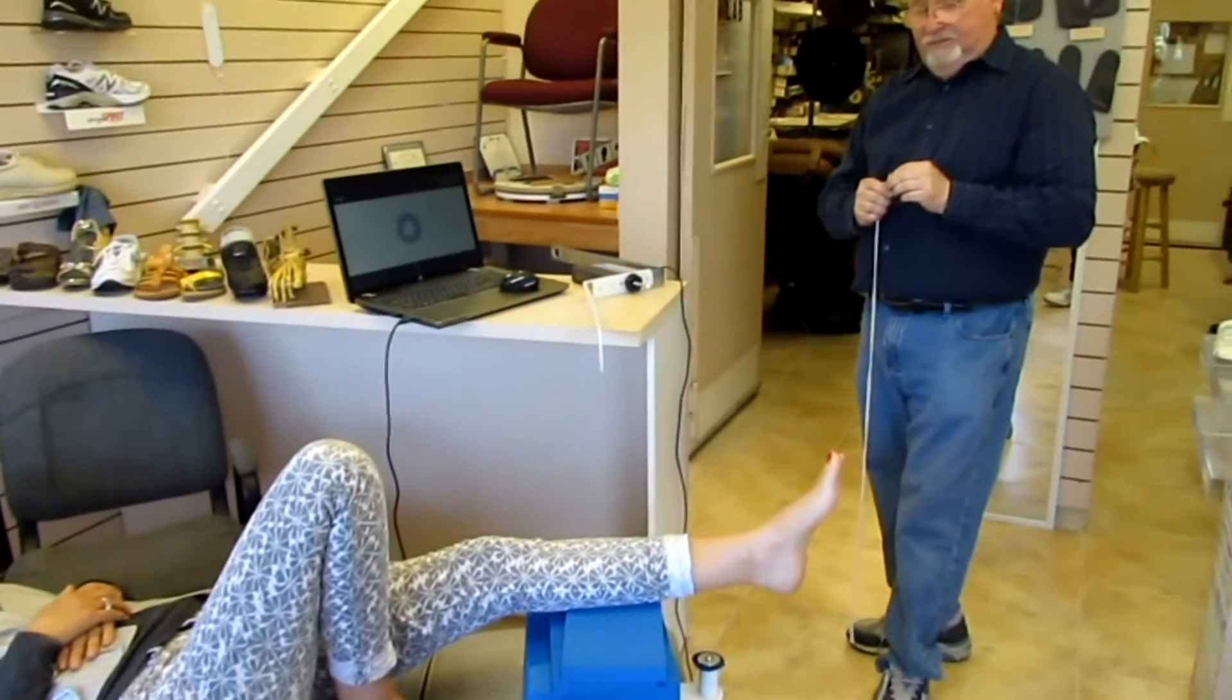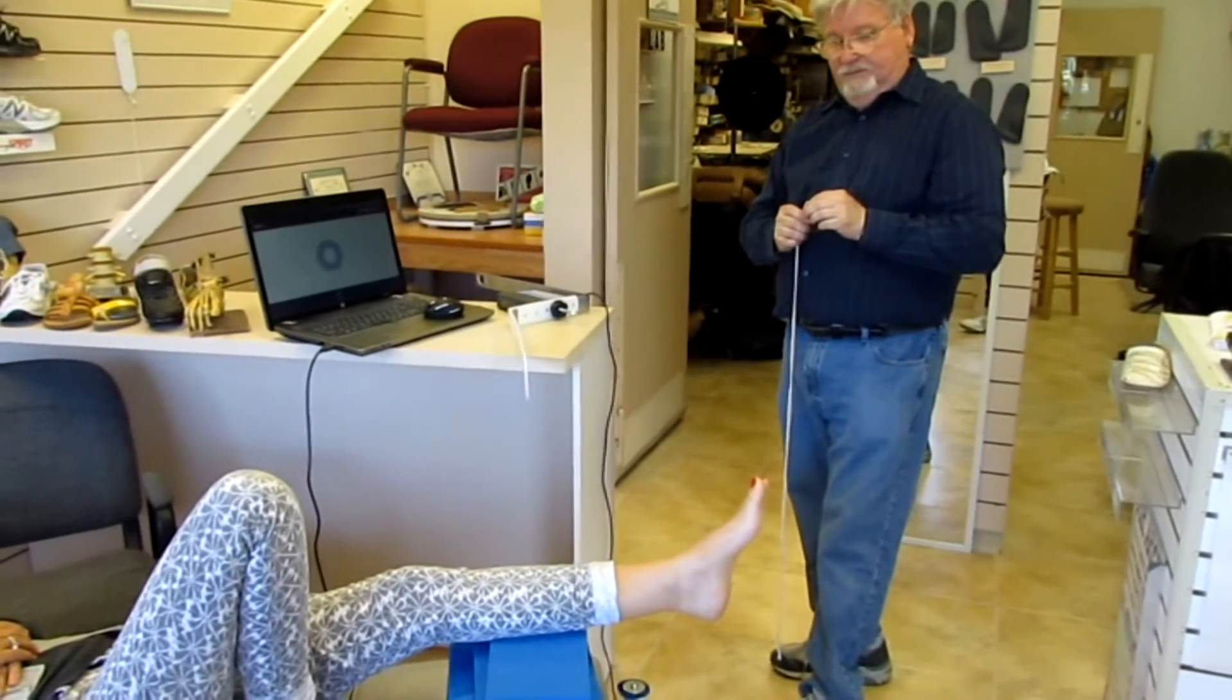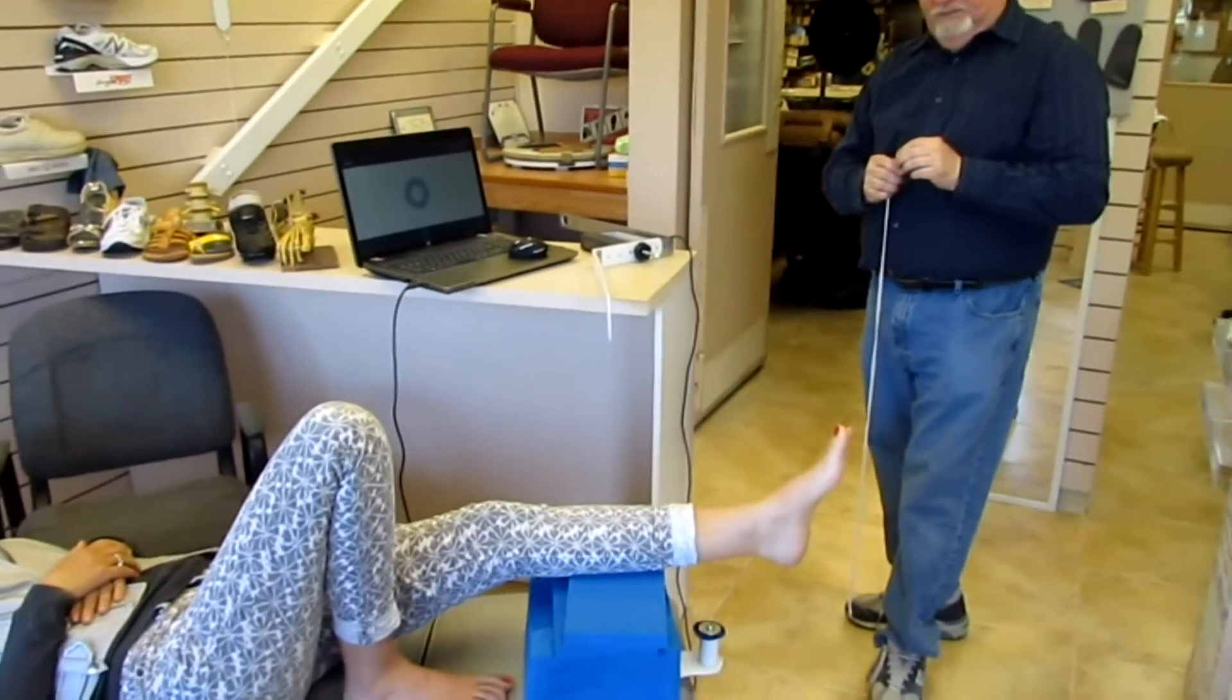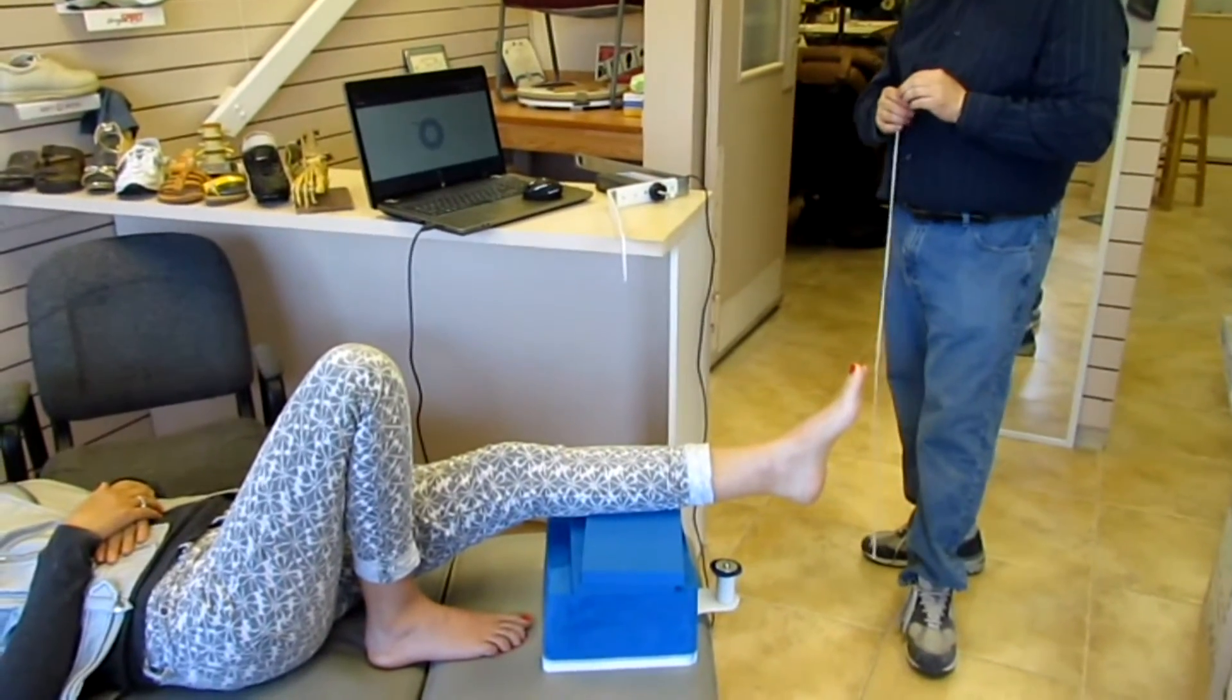Mr. Arch now is going to take a string attached to the toe and foot of the patient and put the patient's foot in subtalar neutral. This takes about 20 seconds to do. He'll demonstrate that right now.